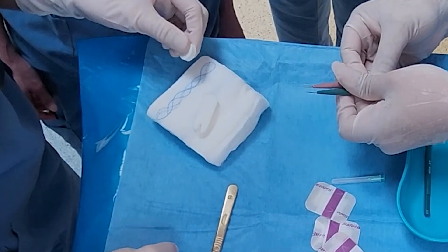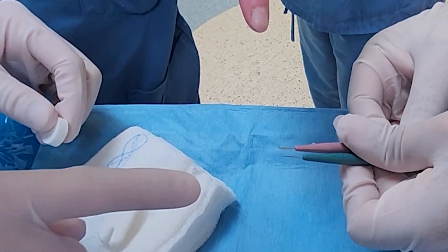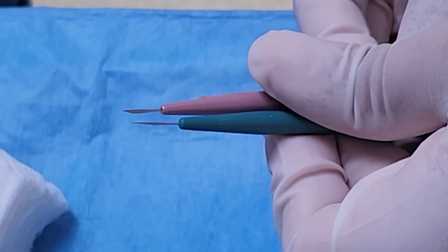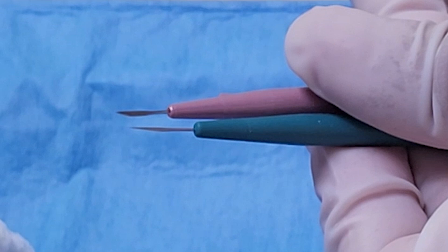We prepare everything before the patient arrives. Here I am showing the two types of knife I use. I prefer the brown cataract or beaver blade because it is short and very precise, and the size of the cutting edge is usually the same as the tendon in children. I don't prefer the blue blade because it is long and can damage surrounding structures, and I also don't prefer a size 15 blade because the cutting edge is too long.